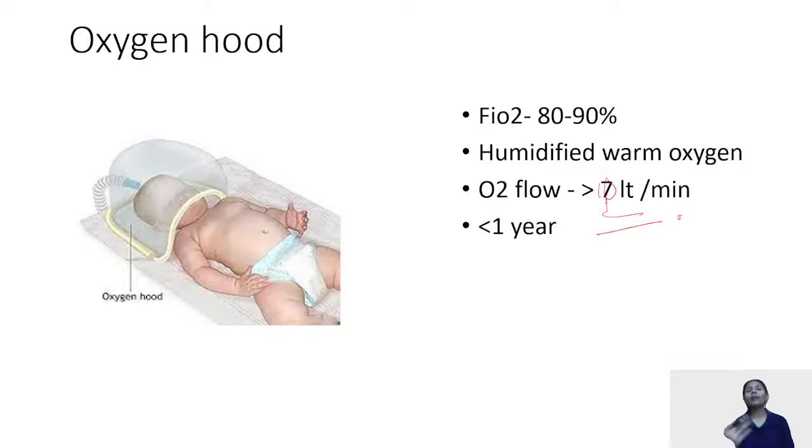The best part about this oxygen hood is that the child is clearly visible, and the child has no problems. The child won't feel claustrophobic, and will have no problems when the oxygen is coming through the hood. The child is not going to pull out your nasal cannulas, your nasopharyngeal catheters, or your face masks.